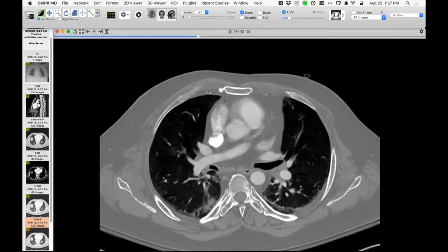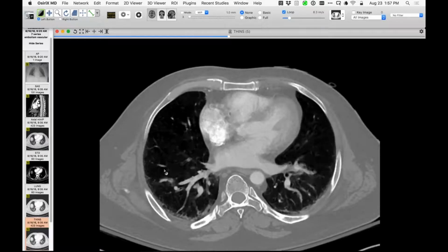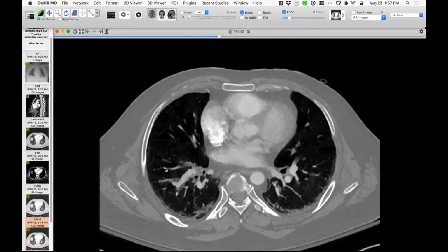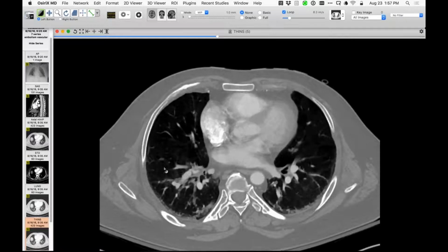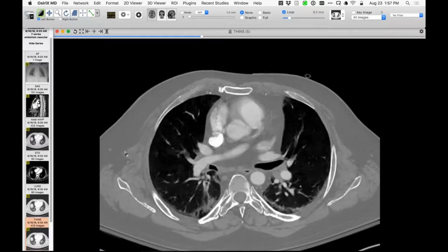Going all the way through the capillaries to veins, no. That would be pretty unusual, huh? I just wonder if some of the stuff got through the capillaries and was coming back. Don't think so, no. Okay. You can see all the places we see it are all in arteries in the different places. Yeah.